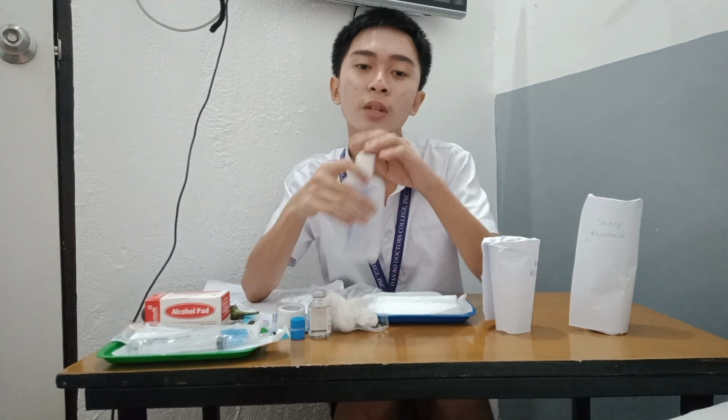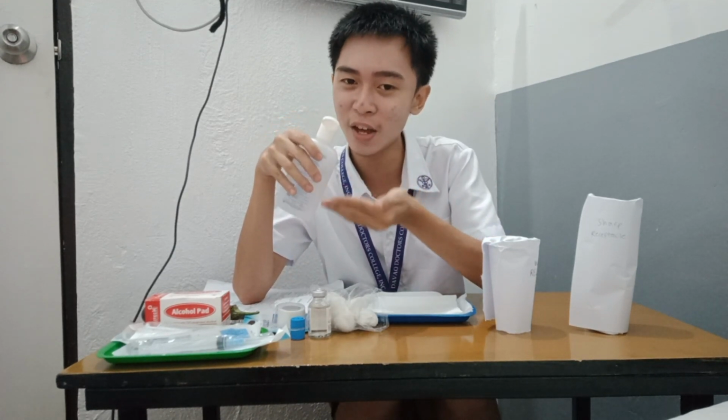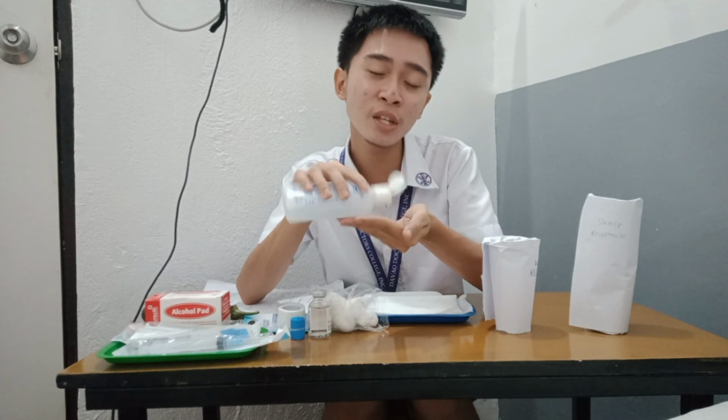So now I'm going to proceed to the preparation of medication from a vial. Perform hand hygiene and observe other appropriate infection prevention procedures. Before I do that, I'm going to perform hand hygiene to observe appropriate infection prevention procedures and to deter the spread of microorganisms.